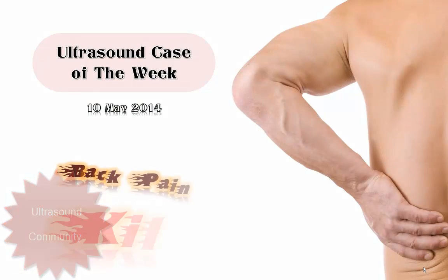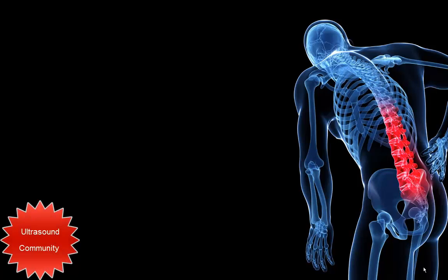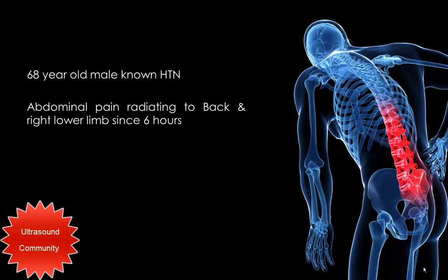A bit unusual case of back pain that ultrasound really changed the management totally. This is a 68-year-old male who's a known case of hypertension. He presented mainly with lower abdominal pain radiating to the back and right lower limb since 6-hour duration.